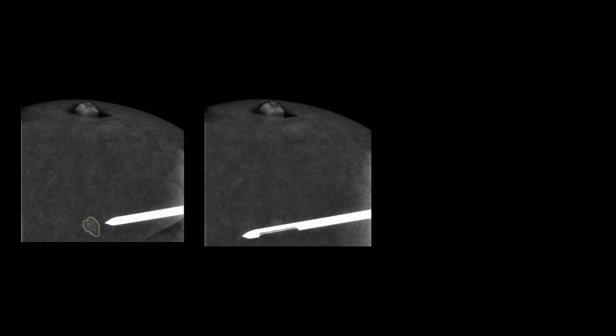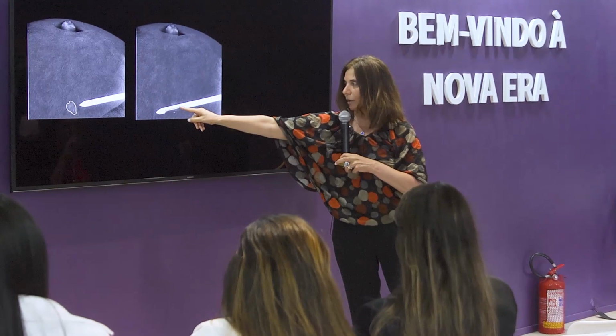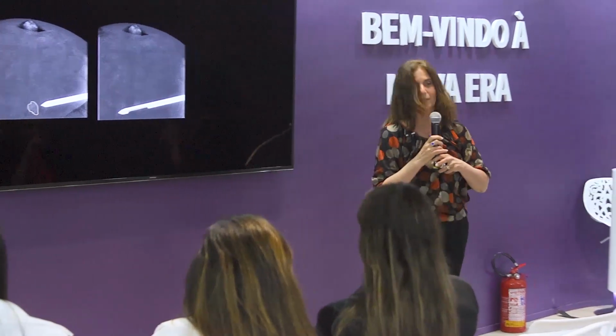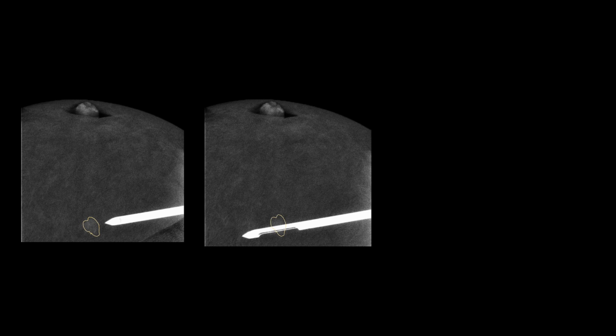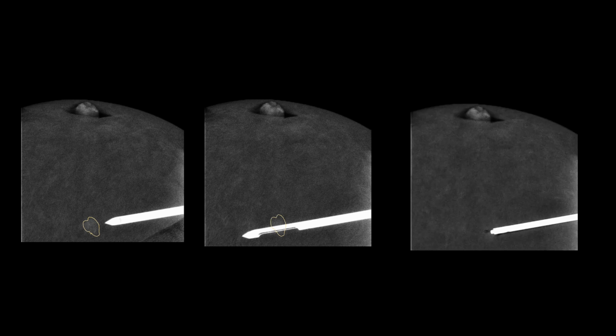This is now while everything is during lavage. We like to take this image because we can see where is the opening and whether we want to take more tissue from here, for instance, right? So it's better actually to have it open while it's lavaging the system, and then deploying the tissue marker. Look, even at the end of the biopsy, we still see a little bit of enhancement.